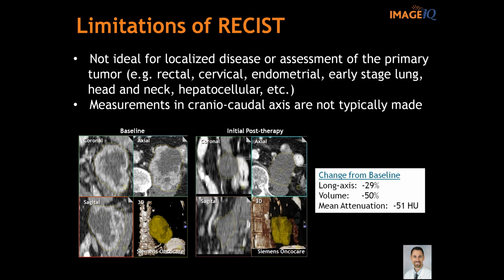And boy, look at this thing. It's not enhancing at all. You'd almost wonder if it was dead. And since this was a solitary metastasis, they actually took it out, and it was, in fact, necrotic and a dead metastasis. So sometimes there are other components besides just longest dimension that we might want to consider depending on what tumor and therapy we're looking at for a clinical trial.